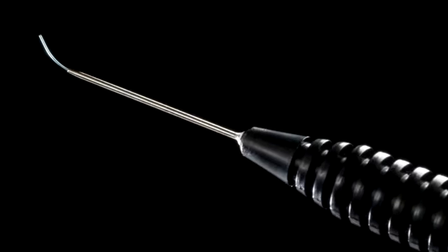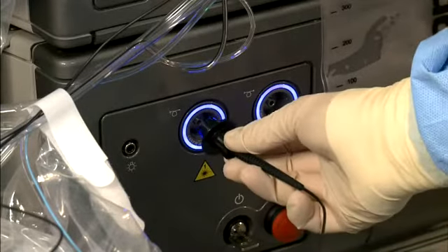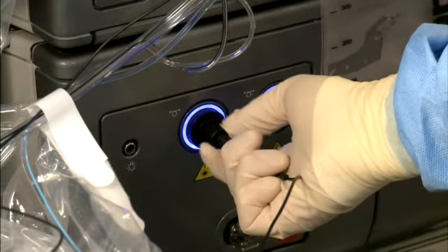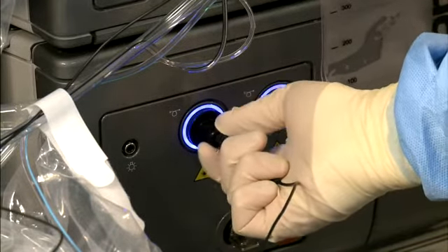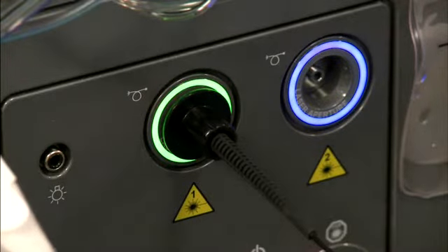Connecting the laser probe can be performed at any time prior to or during the surgical case. Screw in the laser connector to either one of two laser ports located on the left side of the base unit. The flange on the connector acts as a sterile barrier, so this task can be performed by the sterile scrub nurse. The radio frequency identification rings will illuminate green when attached.